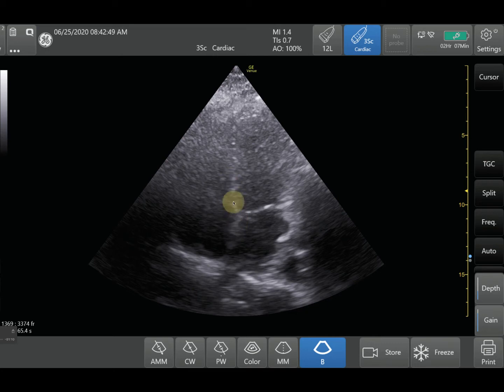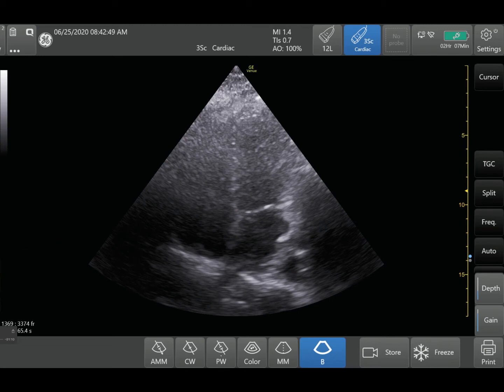Tissue Doppler basically just measures lower velocity signals, and the muscle is going to travel much slower than the blood flow is. So we're going to see how that works here.